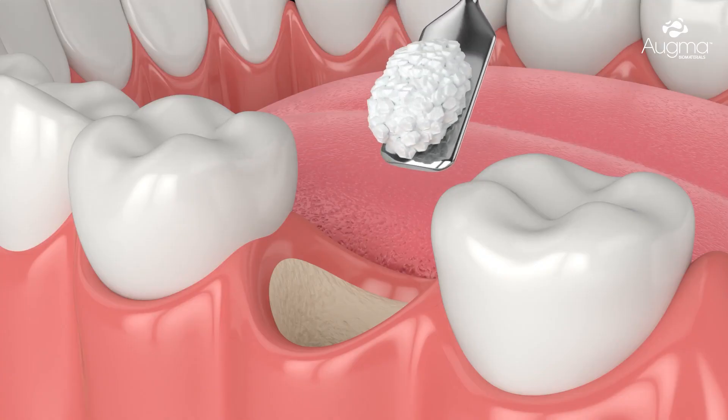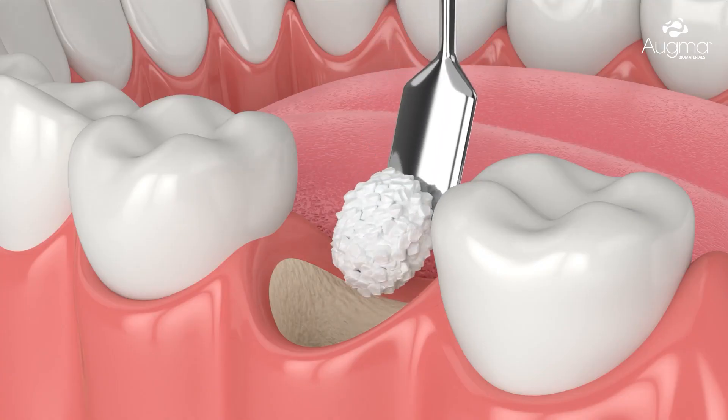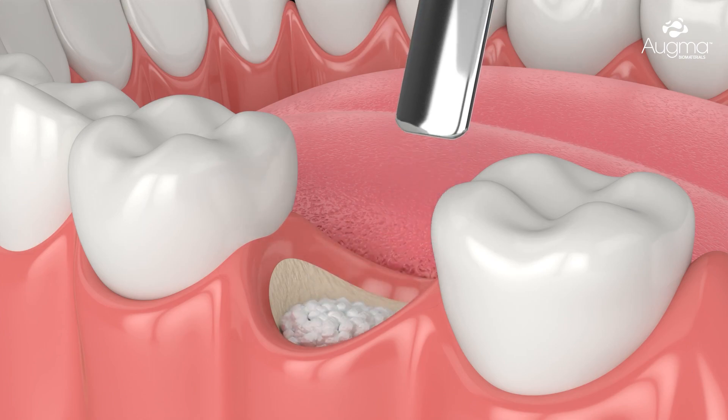Ideally, this is done at the same time as the tooth is extracted. Most of the bone grafting materials integrate with the patient's existing bone. This means that they do not completely dissolve but instead connect with the new bone that is formed. Therefore, only a minimal amount of new bone is formed around them.